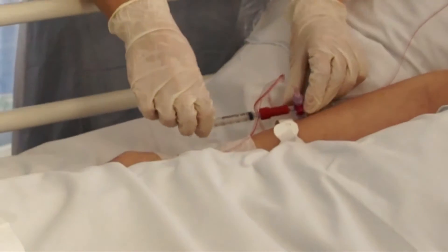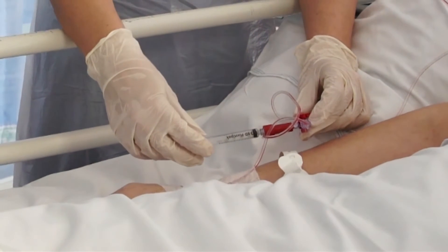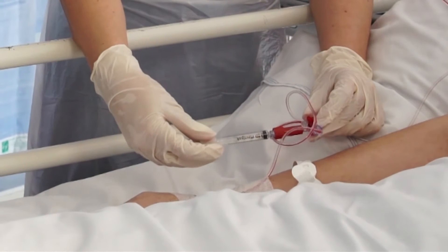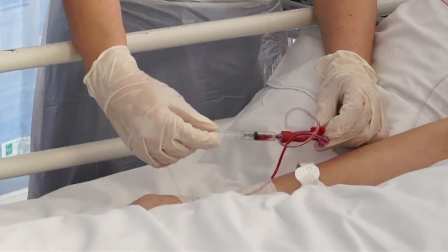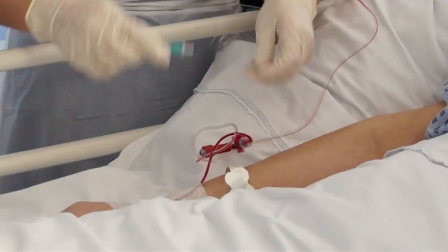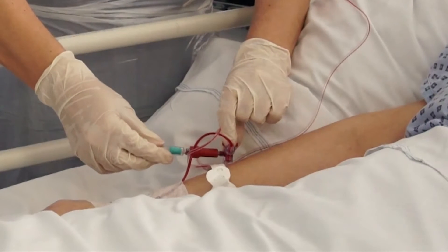This is the arterial connector on a patient with the current arterial line set up. You put your waste syringe on here and you take your sample, you then take your sample syringe to do your blood gas, and as you can see, because of the one-way valve, there is no blood spillage at all.